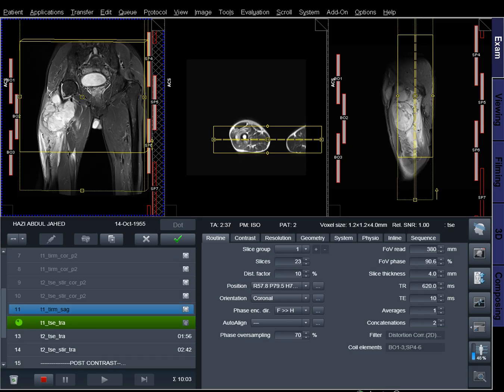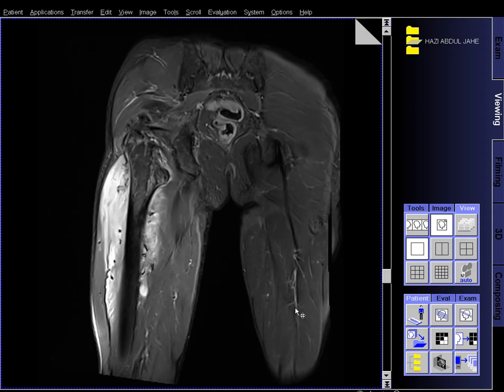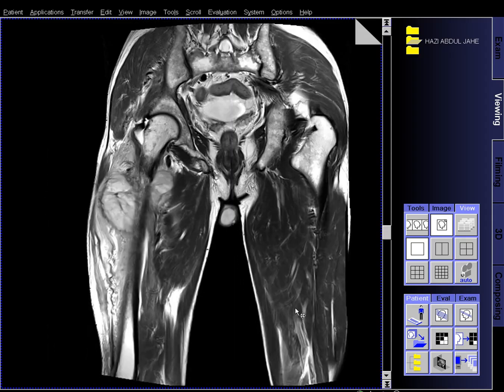Anterior superior iliac spine down to knee joints. Securely tighten the body coil using straps. Center the laser beam localizer over the mid-thigh.